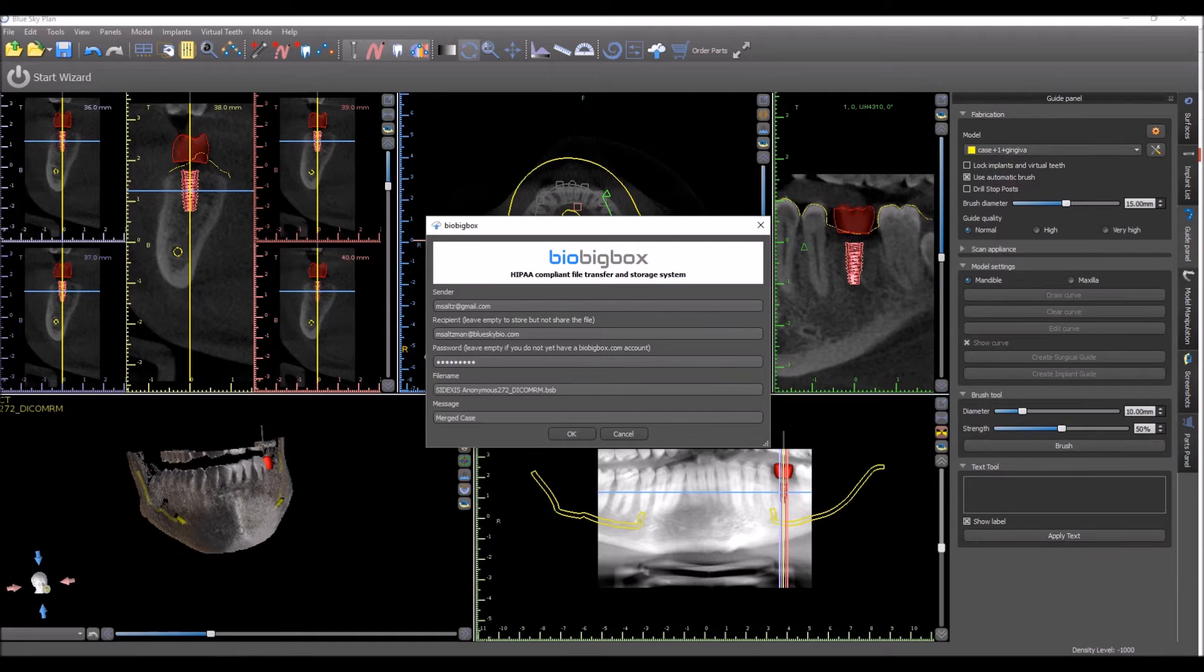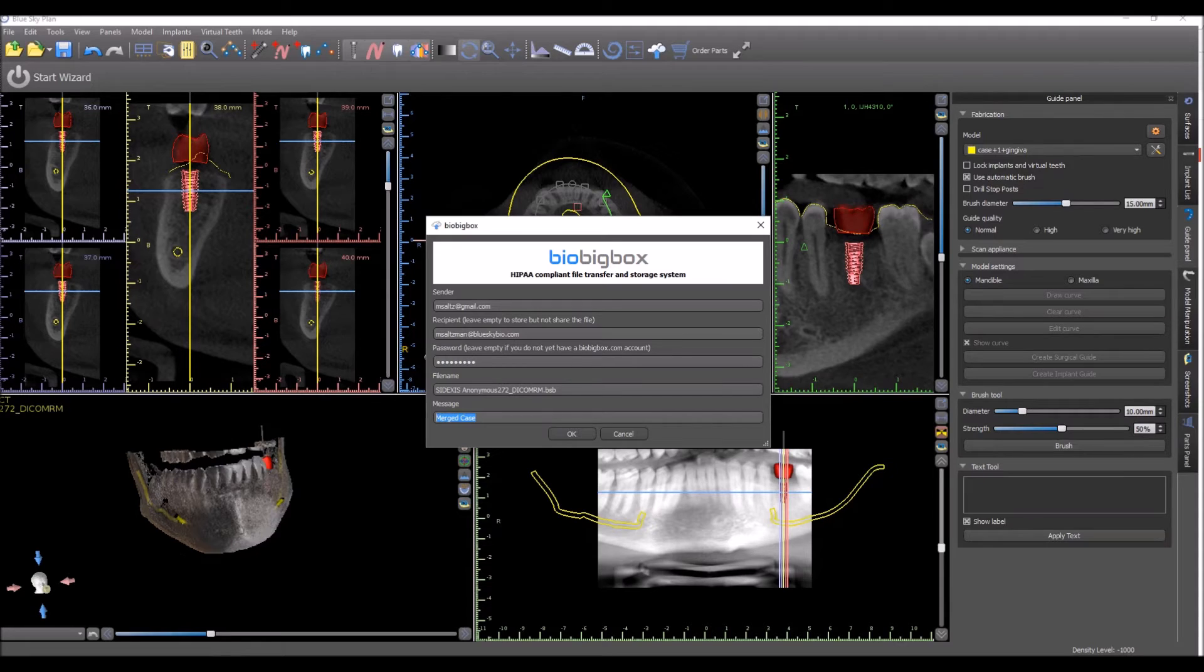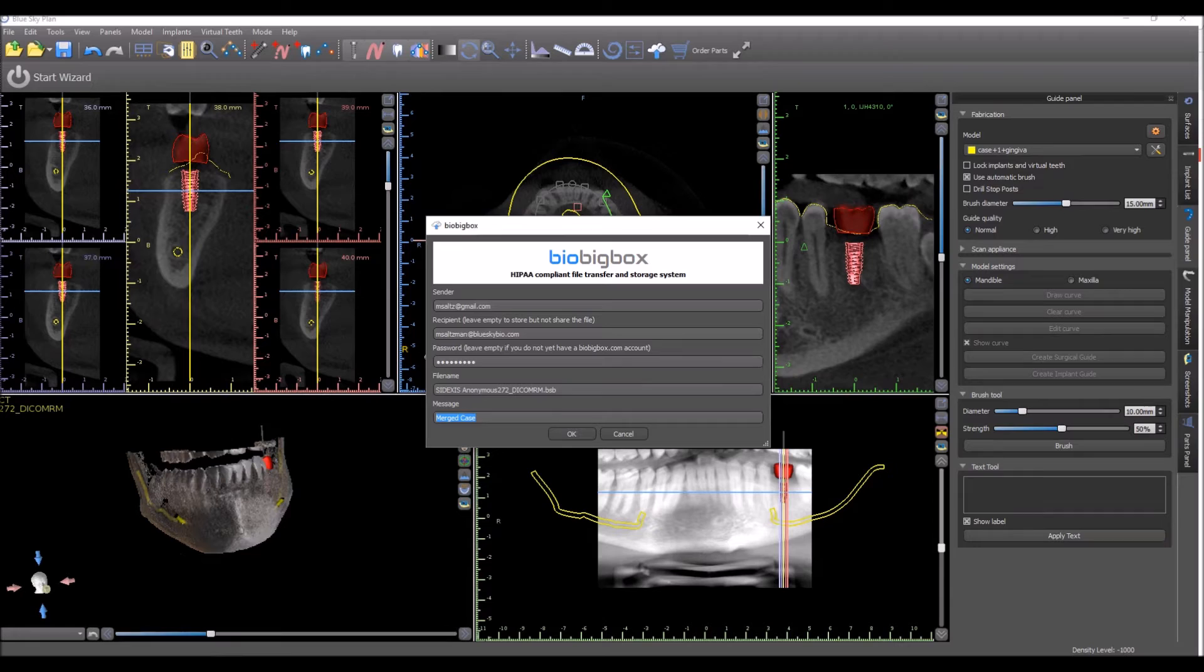In the password field, enter your password for your BioBigBox account. The file name for the Blue Sky plan file is pre-populated and a message is a message that you can type to the recipient that will be included with the case.